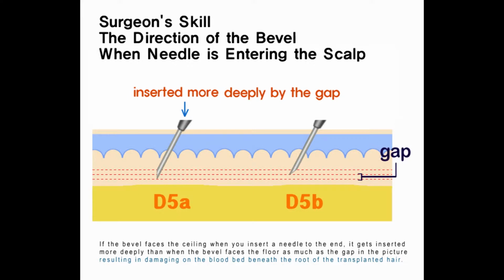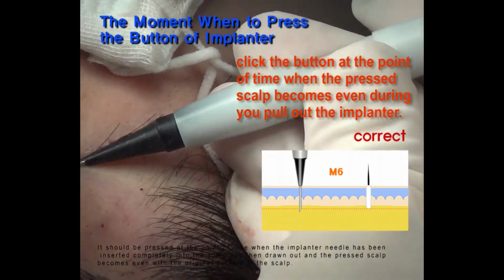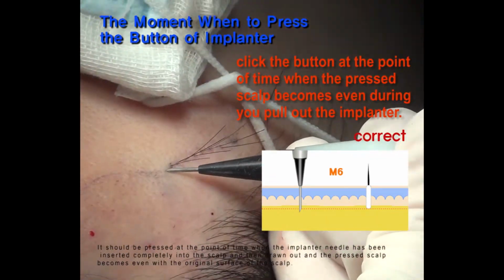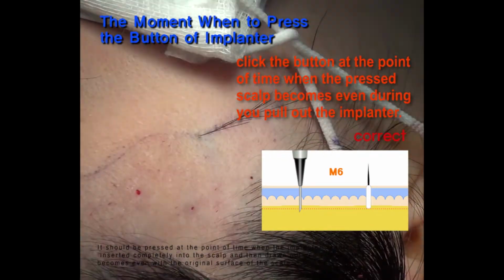If the bevel faces the ceiling when you insert a needle to the end, it gets inserted more deeply than when the bevel faces the floor, by as much as the gap in the picture, resulting in damage to the blood bed beneath the root of the transplanted hair. The button should be pressed at the point of time when the implanter needle has been inserted completely into the scalp and then drawn out, and the pressed scalp becomes even with the original surface of the scalp.